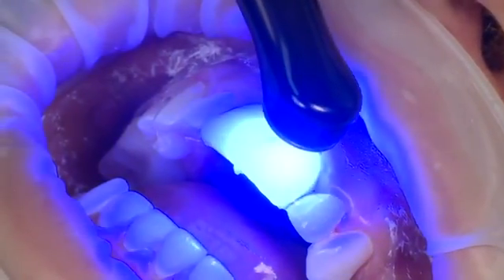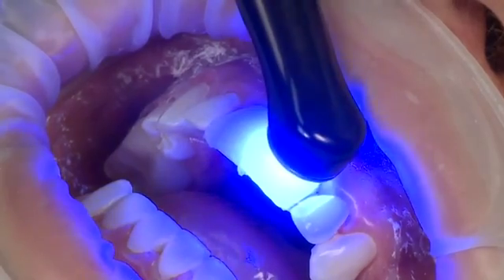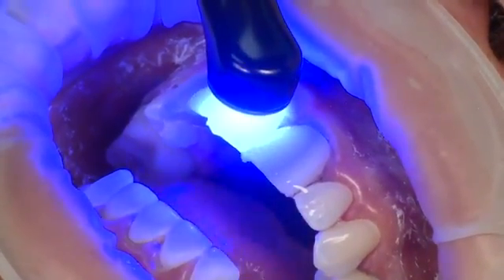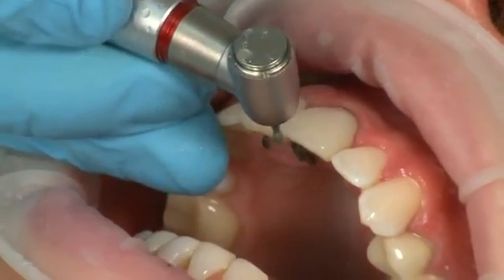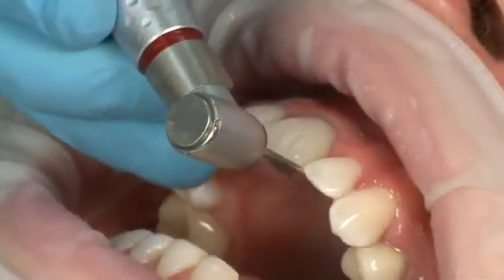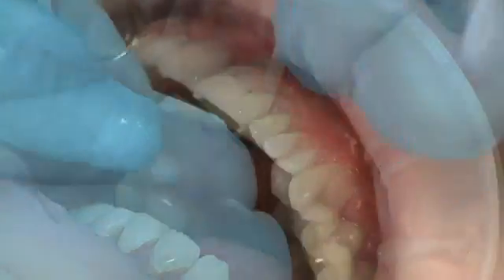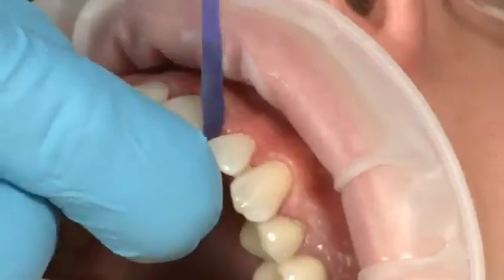Fully cure the composite with Velo on the lingual and facial surfaces for 20 seconds each on standard power mode, or 40 seconds each if using a curing light with an output less than 600 milliwatts per centimeter squared. Finish the cervical margin and the incisal edge with a fine finishing diamond or a carbide finishing bur. Finish the interproximal margins using an interproximal diamond or a carbide finishing bur. Continue to finish interproximally using finishing strips and polishing strips.